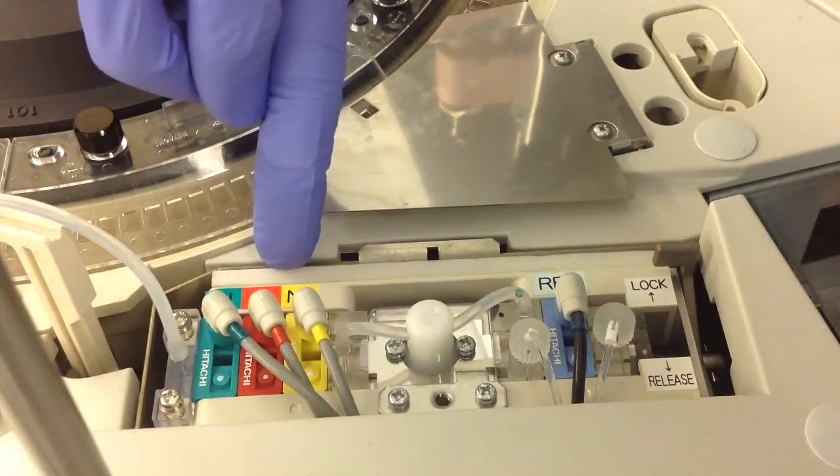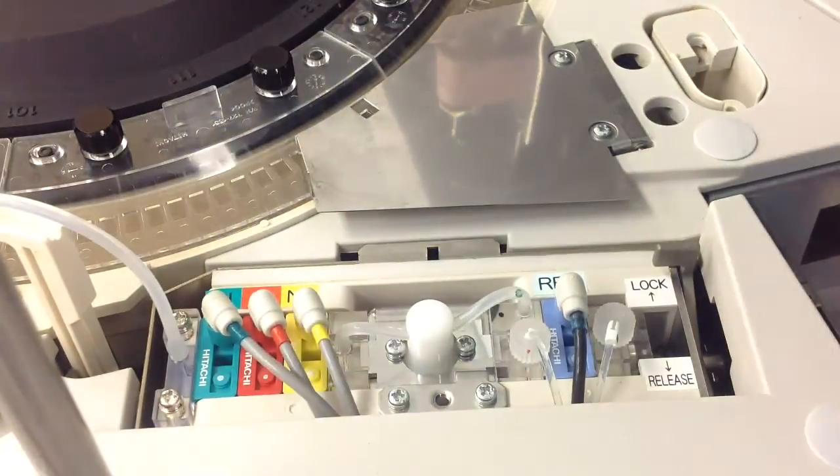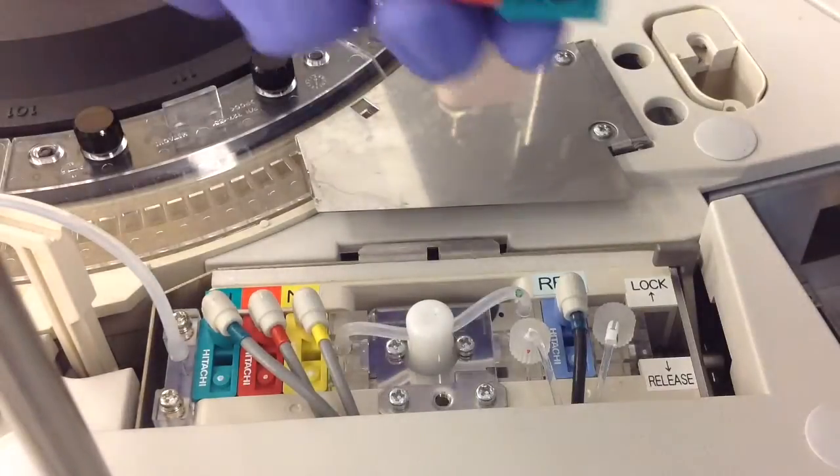Today we're just going to be changing the measuring cartridges, which is done every two months. The reference cartridge is actually done every six months.